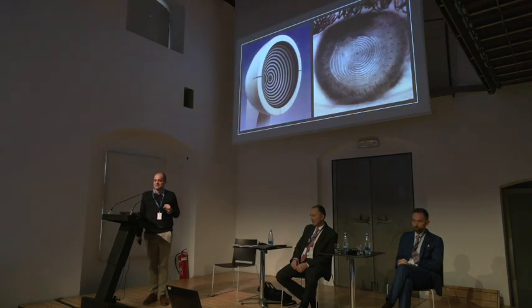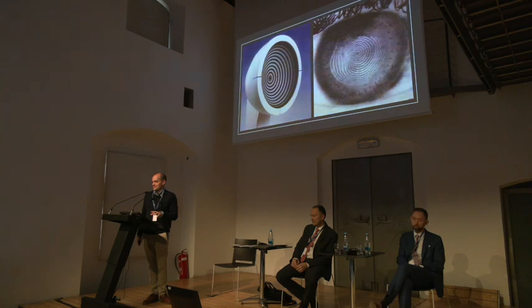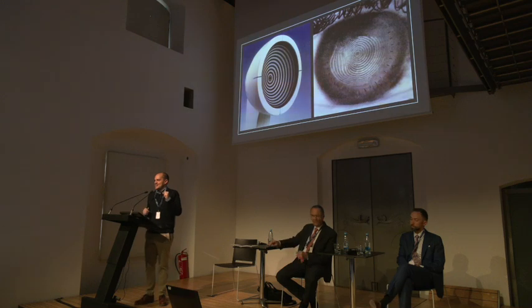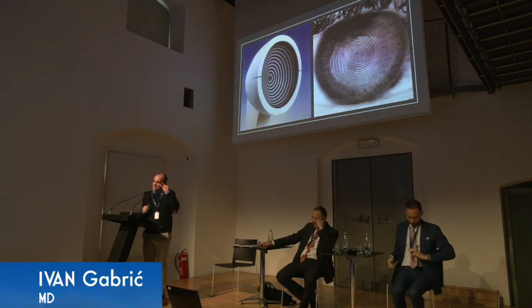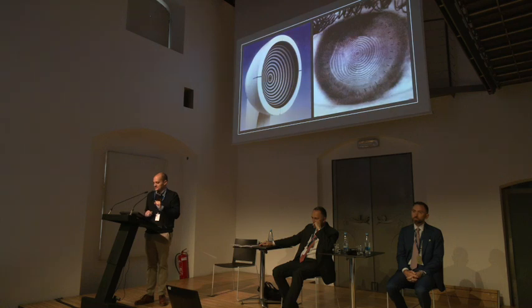The Placido disc is an amazing piece of technology dating back to mid-19th century. But the other name for this is instant topography, and the word instant is so important. As Farhad showed, you know what? The tiny amount of changes while the camera is rotating can create a lot of issues. So instant, it has a reason why it's instant.